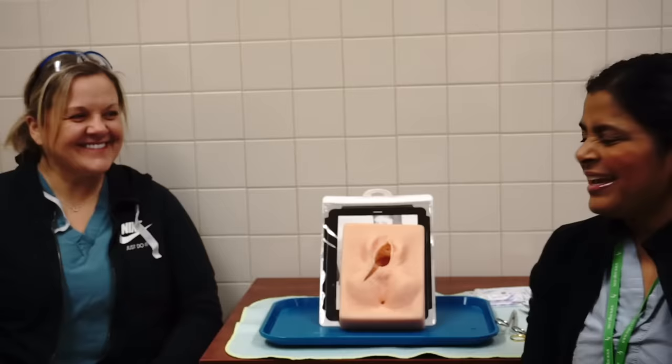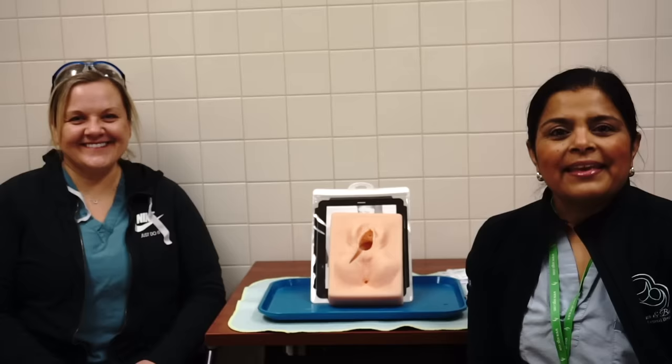Hi, my name is Dr. Rashmi Bhargava. I'm an obstetrician gynecologist in Regina, Saskatchewan. In this video, I will be demonstrating repair of a perineum that has sustained a right medial lateral episiotomy. I will be talking my way through the repair and it is my hope you will glean some helpful tips on how to repair perineums. Assisting me today is Darla Hall, a nurse who works on labor and delivery. I hope you'll enjoy the video.